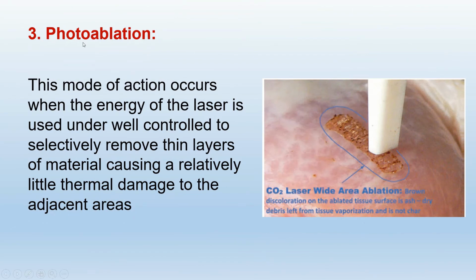The third effect is photoablation, and this occurs when the energy of the laser is used under well control to selectively remove thin layers of a material. During that, it will cause relatively little thermal damage to the adjacent tissues. So photoablation means little thermal effect on the adjacent areas when we need to selectively remove certain layers of a material using the laser.